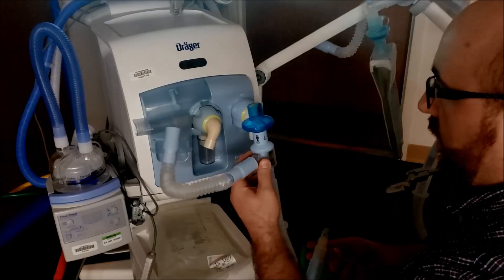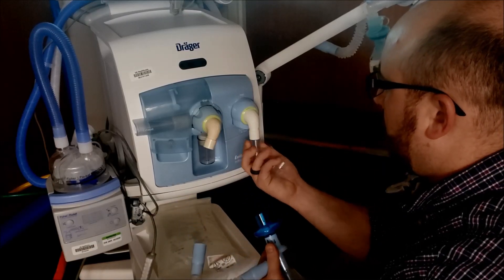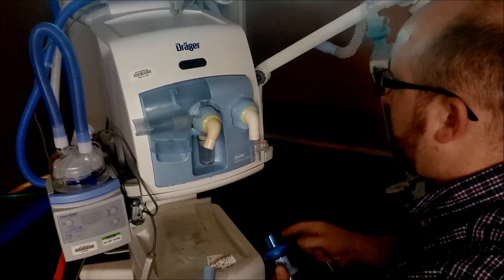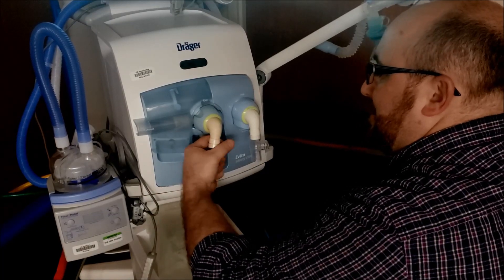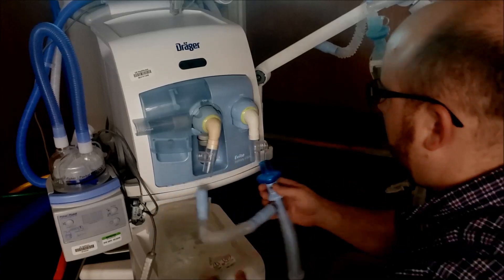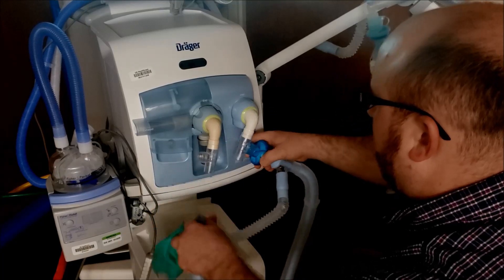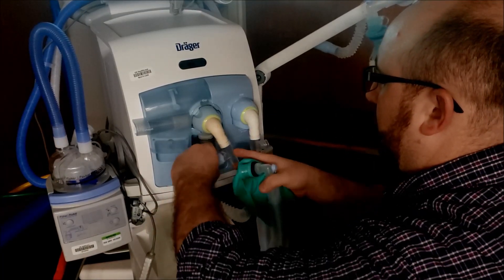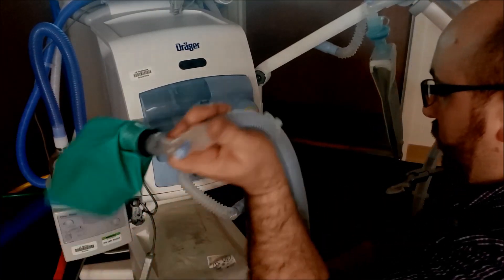Let's go down and hook this thing up. Take the first circuit — we're actually going to put the nebulizer T's on here. That's the inspiratory side with two ports, now the expiratory side with two ports. You can see that there. Inspiratory side on this one we hook up over here, and hook the expiratory side up here. So there's the first one hooked up and that circuit is ready to go.